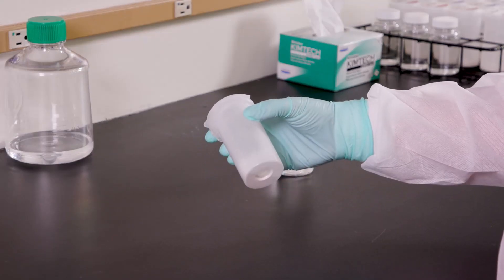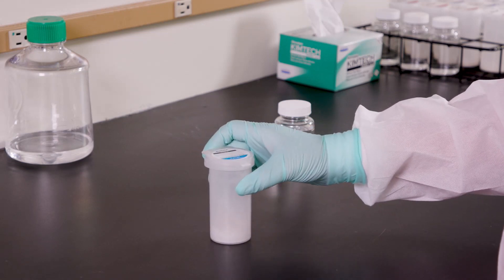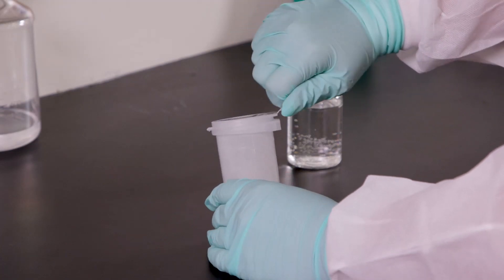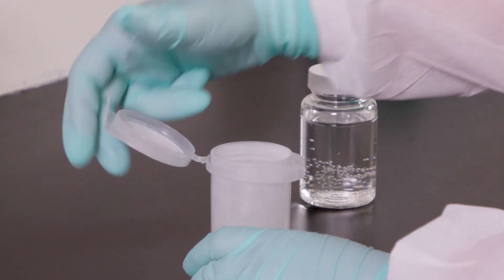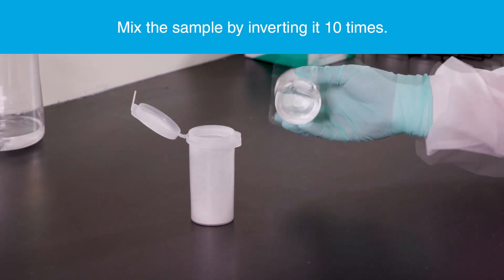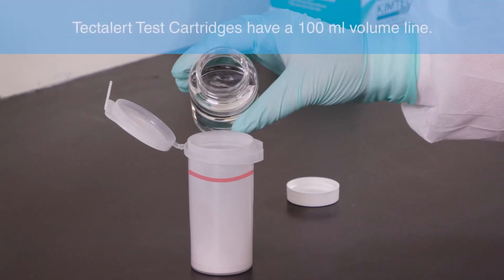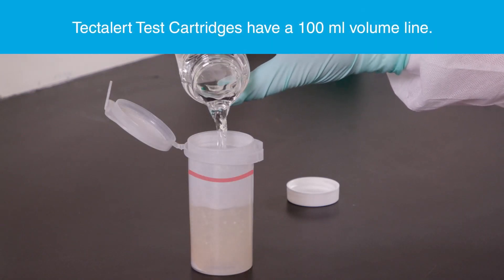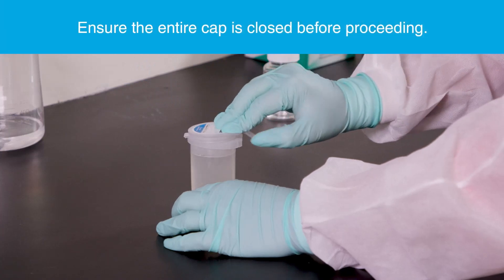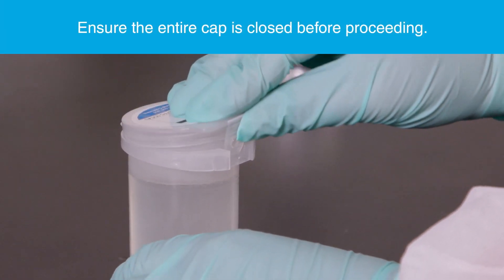Before beginning the test, the cartridge can be gently tapped to loosen any compacted powder. Open the TECTA alert ECTC cartridge by lifting the textured flap. This will release the tamper-proof nub. Mix the sample by inverting it 10 times, then add 100 ml of sample to the TECTA alert ECTC cartridge.